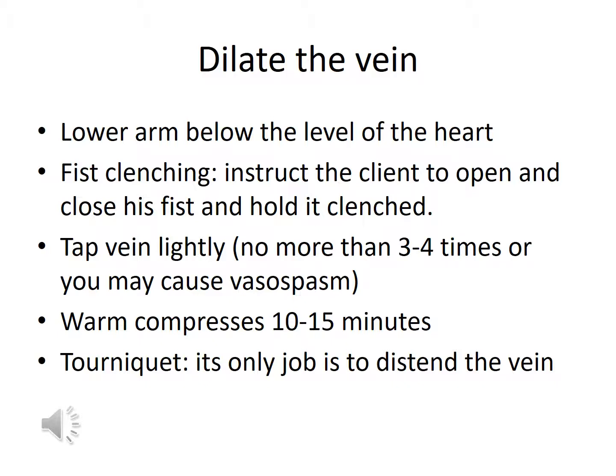You also use a tourniquet. Its only job is to distend the vein. And once that's been done and the vein has been accessed, you need to remove the tourniquet, because a tourniquet left on for 2 minutes or longer can cause tissue damage.